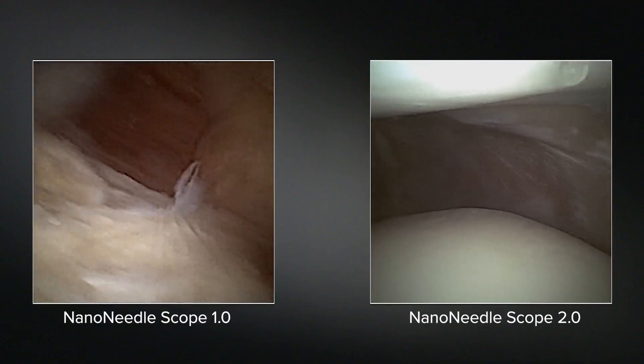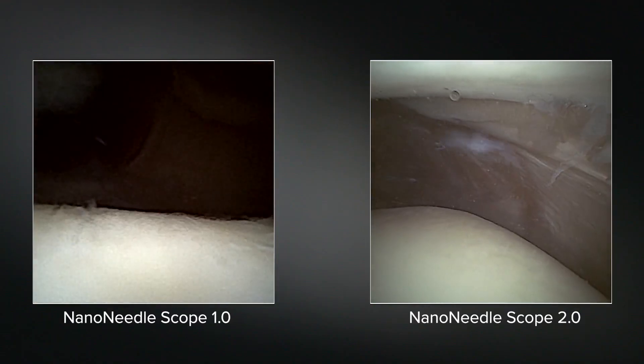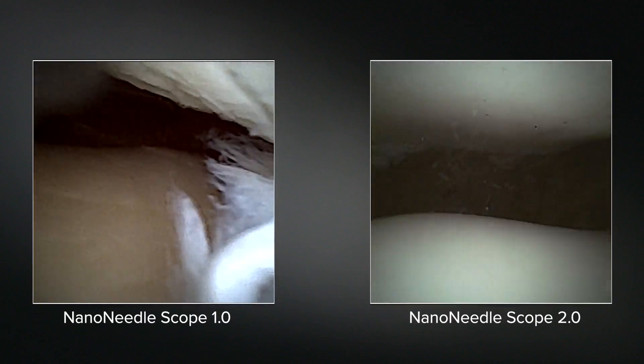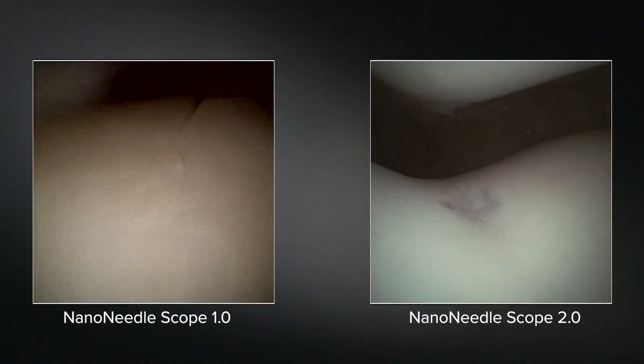Now we're going to go up to the patellofemoral joint. Compared to Dr. Frank's video, the colors, definition, and illumination of areas that aren't exactly in the foreground is significantly different. We can see the full scope of patellar cartilage, plica, trochlea, and the lateral facet. Now we can watch patellar tracking and evaluate that trochlear cartilage lesion. This is also extremely useful for MPFL reconstruction if you want to be looking from that superlateral portal, or even to check your tracking throughout the case and check your graft passage. The nano is great for that because all you need is just a tiny little poke hole.